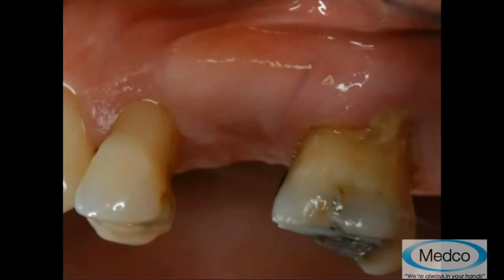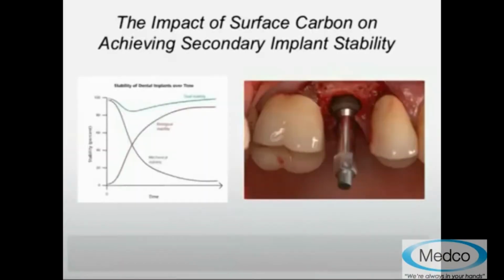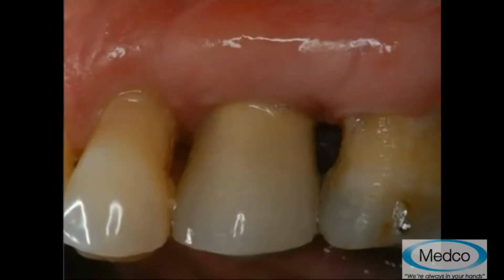And this woman received a single tooth implant in a healed site that was not grafted. And she was constantly, because of work, etc., wondering when we could load this implant. Well, we know all about the dip period, and according to this enhanced surface, by 4 weeks, everything should be hunky-dory and we should be able to load this implant. That was not the case. Though I did achieve a final outcome, I had a major problem that occurred in this case.